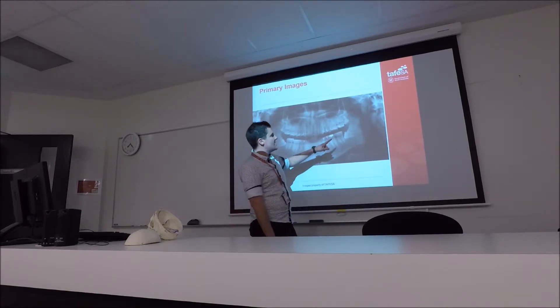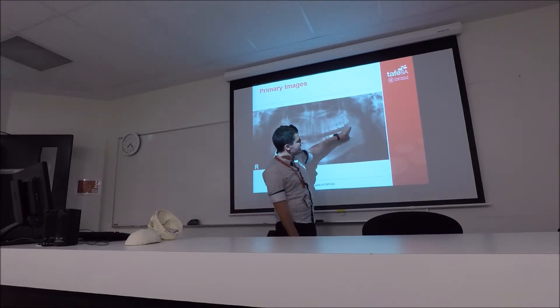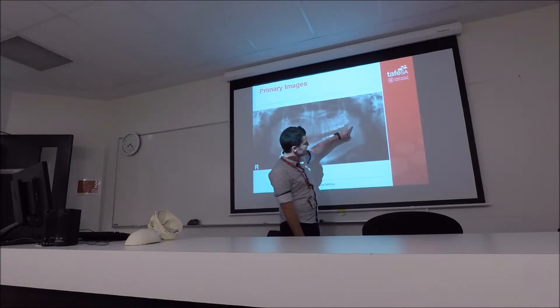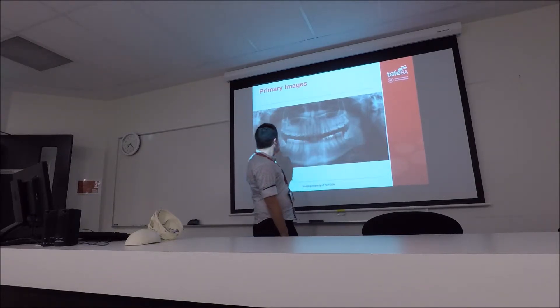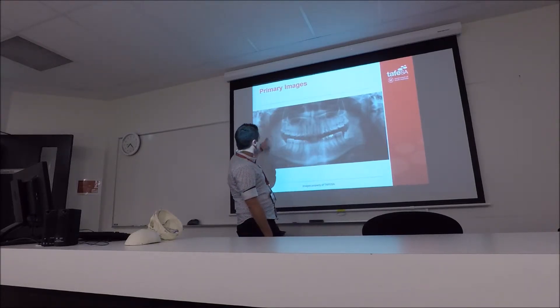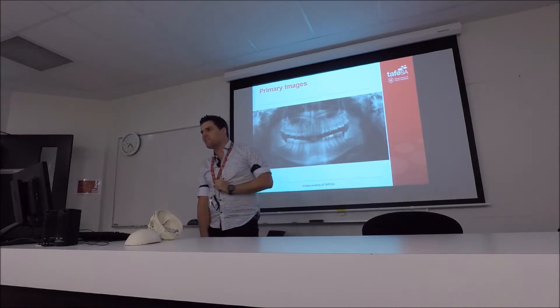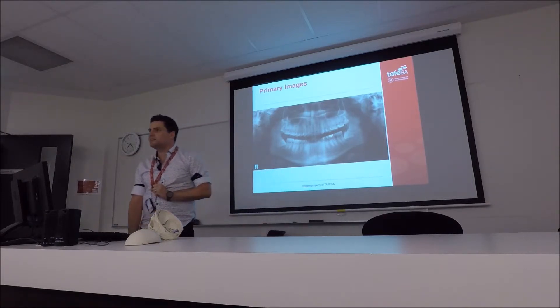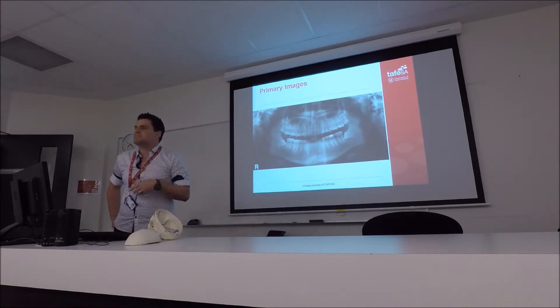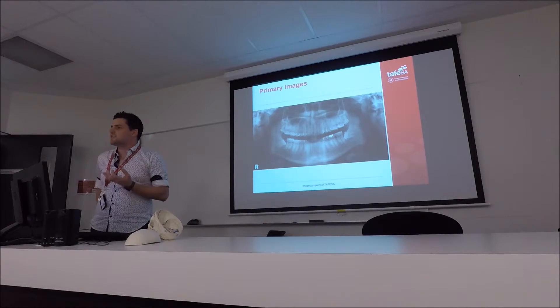Now, at the back here, can you see how I've got this tube running down here? You can see this back part here, and a back part here in a very faint white colour. Like it's a very faint white one? That's because it's your tongue and it's soft tissue.